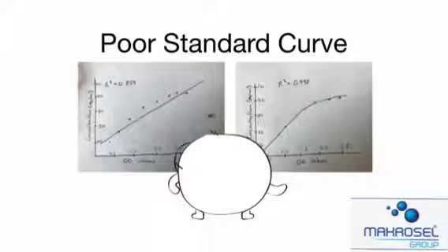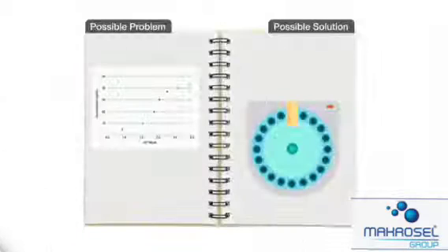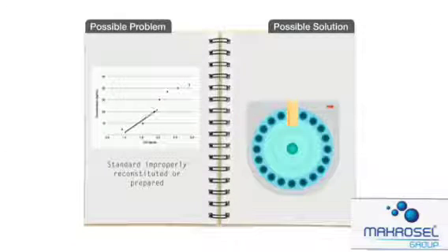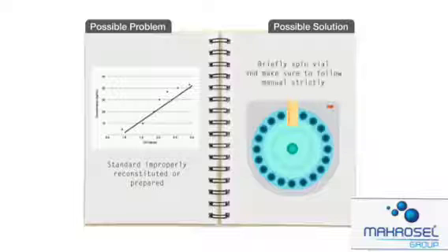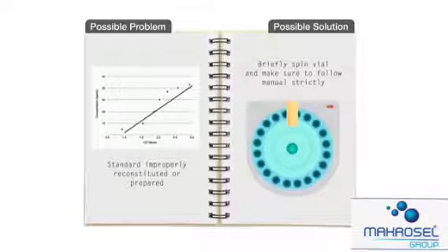If you are getting a poor standard curve, then this may be caused by the standard being improperly reconstituted or prepared. In this case, briefly spin the vial and confirm the standard is thoroughly dissolved.